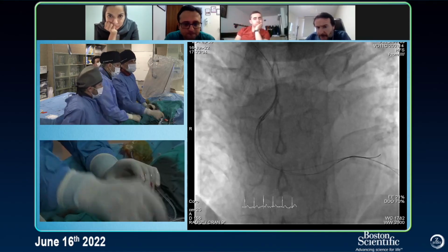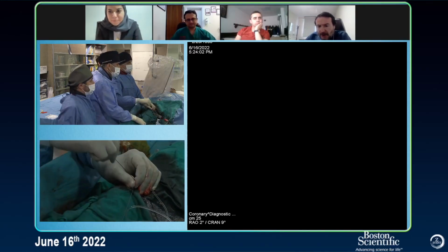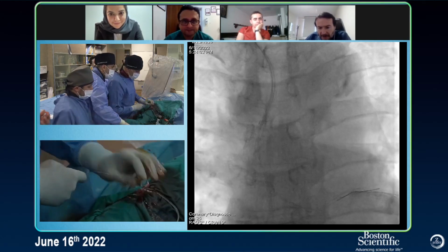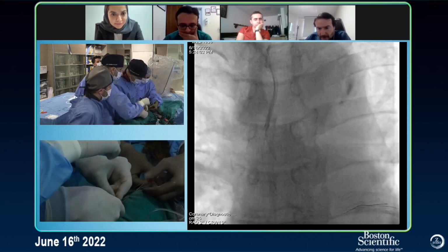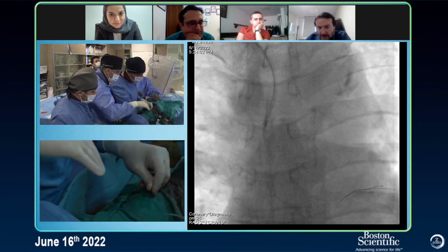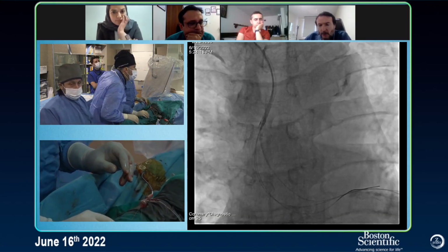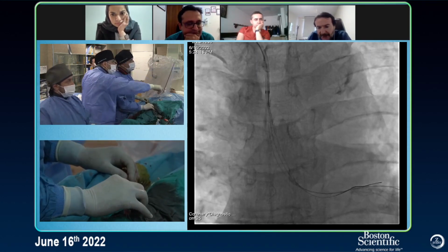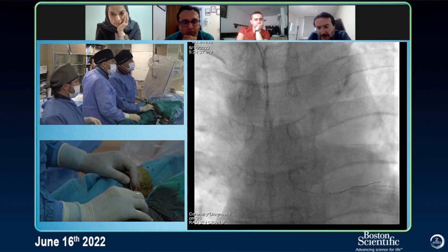All right. The good thing, Nihat always has some solutions for such kinds of things. Nihat, what do you think? What should we do? Everything happens in front of your eyes. I didn't push that much. When I feel it's not crossing, I try to pull it, and I don't know why it happened. What's the brand of the stent? It is distally. It is not in the guiding. The stent is on the wire now, and it's outside the guiding catheter.